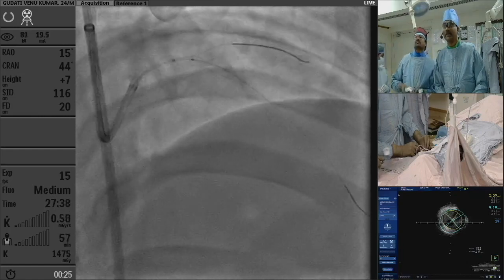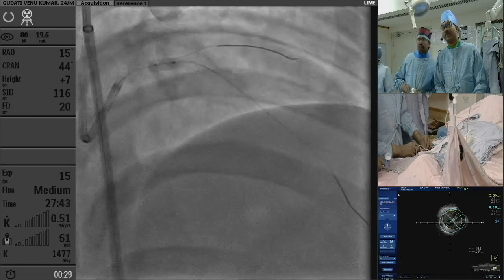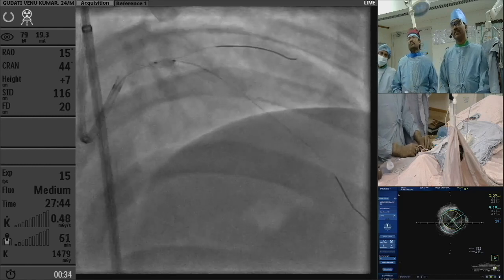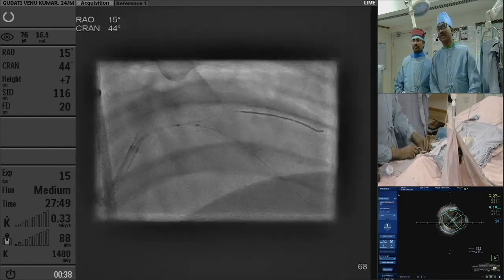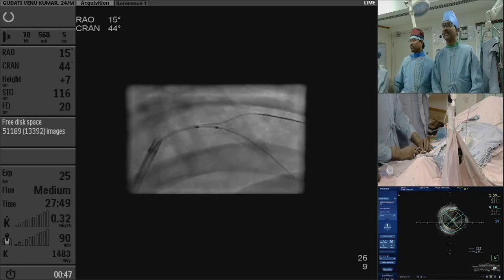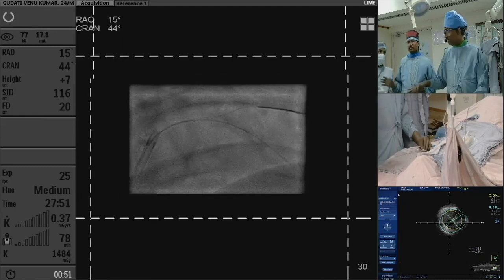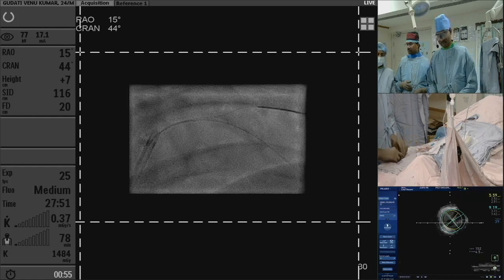Yeah, dilate. Negative. Just give me sunburst. Just make me understand what I covered. Yeah, 3 balloon, please. I think we covered everything. Okay. 3 NC, please. NC, 8 or 12, no problem.